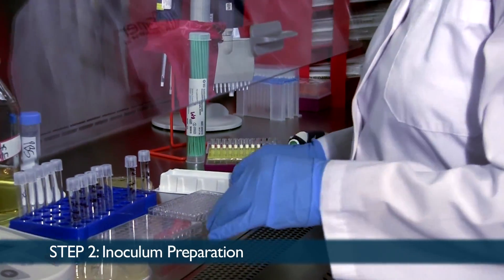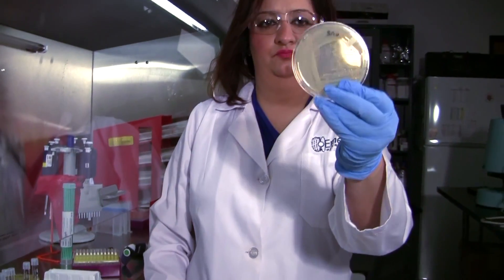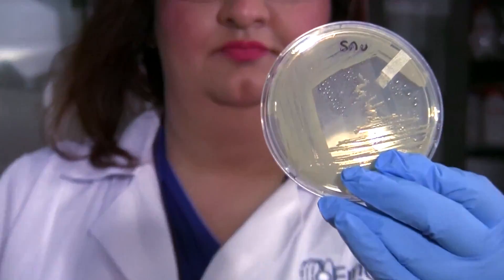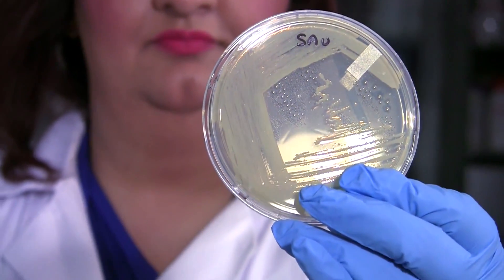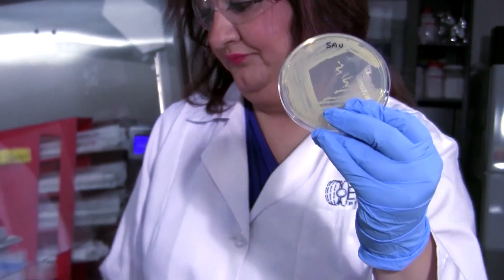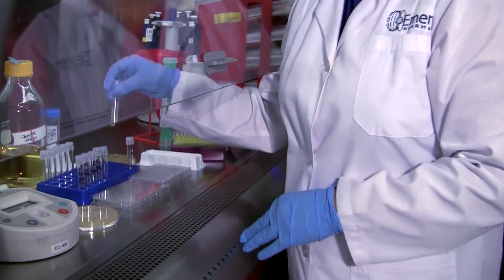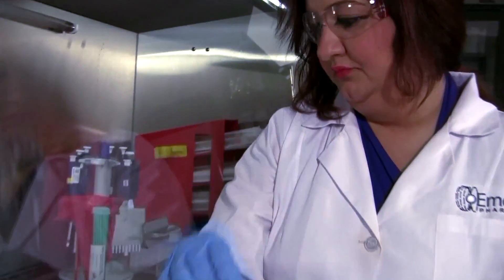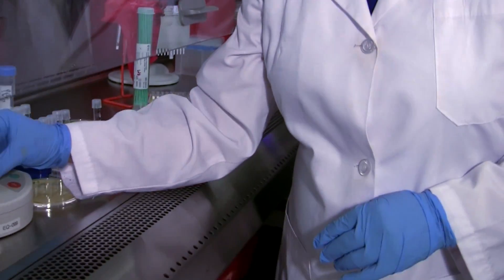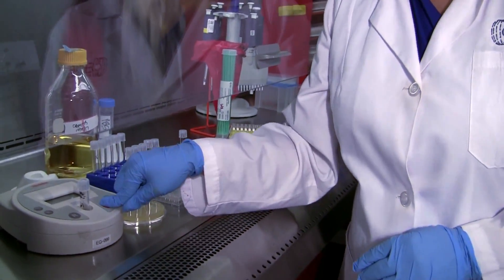Step two is inoculum preparation. Here I have a Staph aureus strain that I will be using as the test organism. This is a QC strain that I will be using to prepare the bacterial inoculum of 0.5 McFarland turbidity standard, verifying the OD by using a colorimeter.